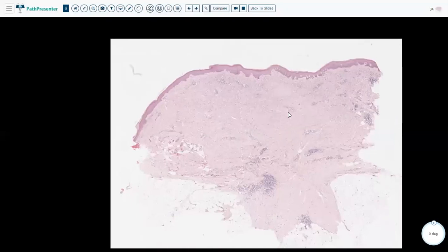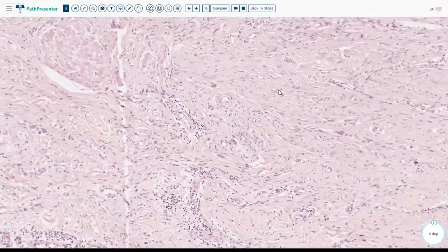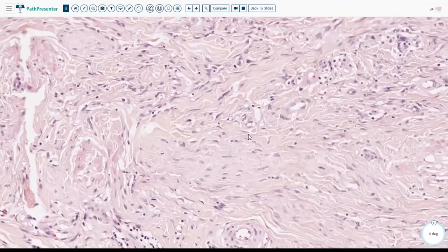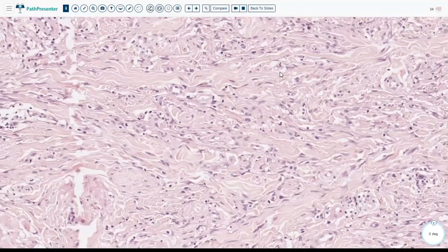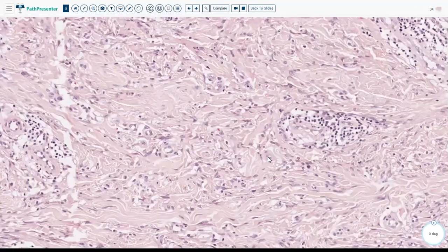Okay, and if they tell you that they want to rule out a nevus or melanoma, you can just think of it as a previous recurrent nevus or something. But if you look closely, there are a lot of lymphocytes and spindle-shaped cells in the dermis. And what scares you even more is that when you use Melan-A stain for this one or HMB45, it will always be negative. It's only positive with S100, so you should keep that in mind.